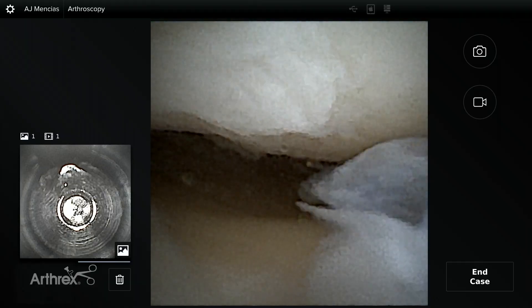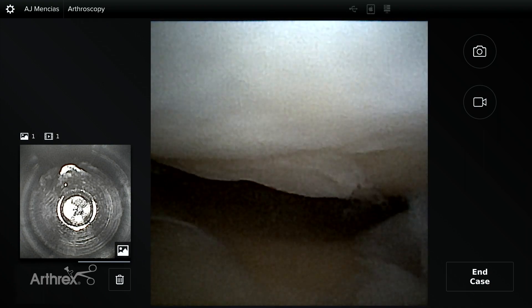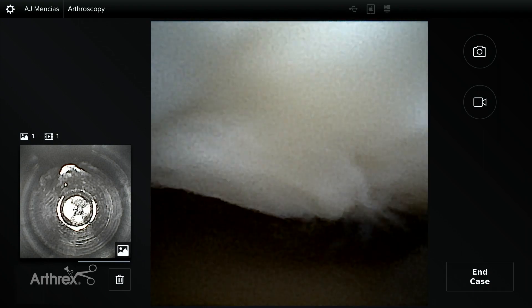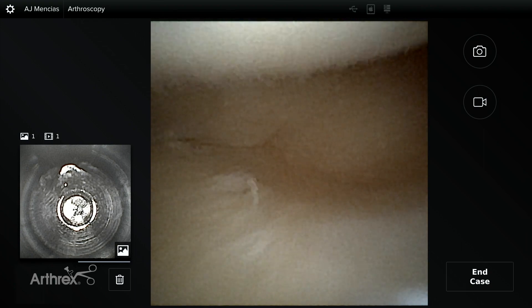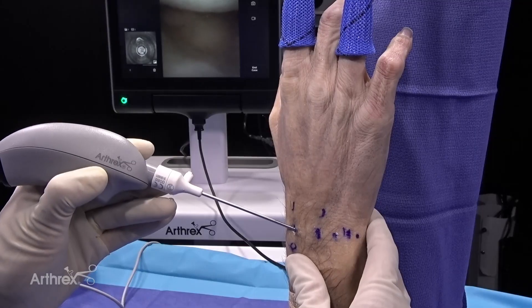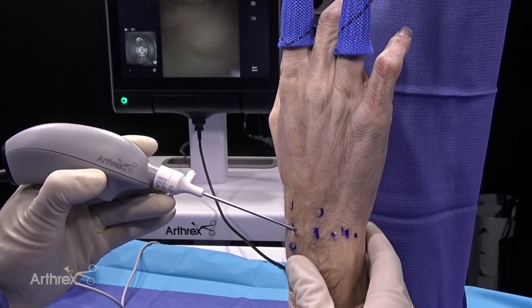Here's the normal appearing scapholunate ligament, and you're really looking at it in a manner that you don't typically get to see. Right above you can see the scapholunate ligament and the normal concavity of the scapholunate ligament. As I drop into the area of the TFCC and the ulnocarpal joint, one of the initial feelings I'm having with this arthroscopy is that the maneuverability is unbelievable.